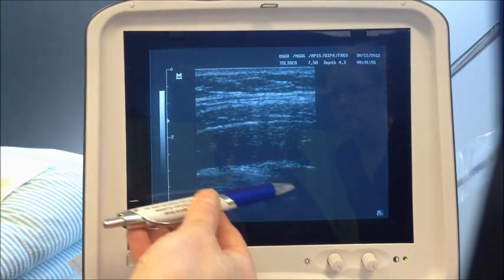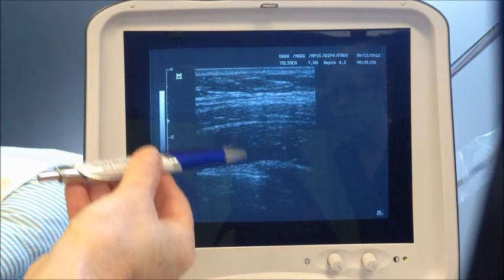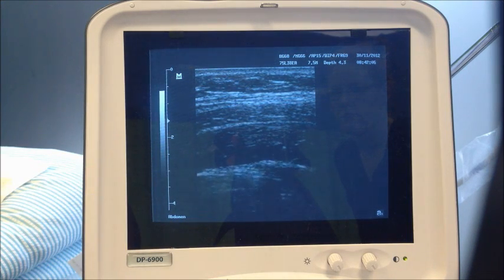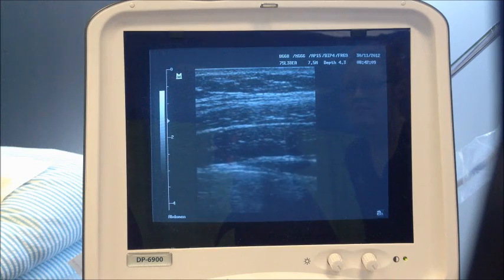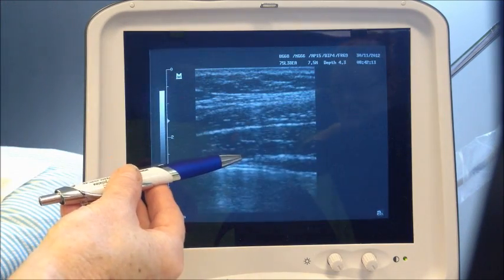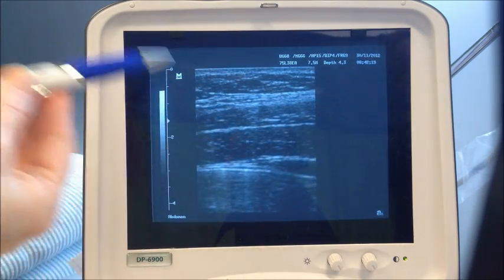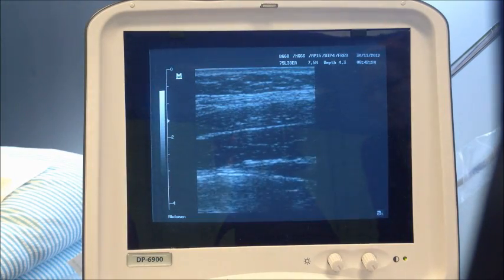Gently holding it, so we've got a thickening here, it's working around the side. Keep gently breathing, holding the contraction, and now let go. Relax all the way. Thank you. Good. So with Christina, we do see some internal oblique, and providing, again, that doesn't dominate as we continue to do exercises, that's fine.